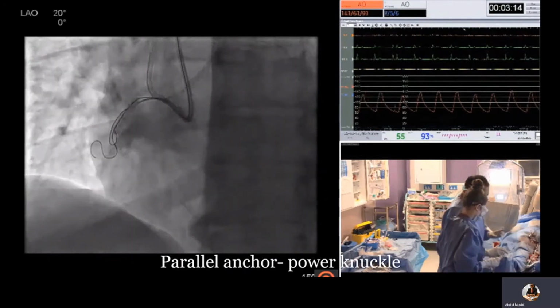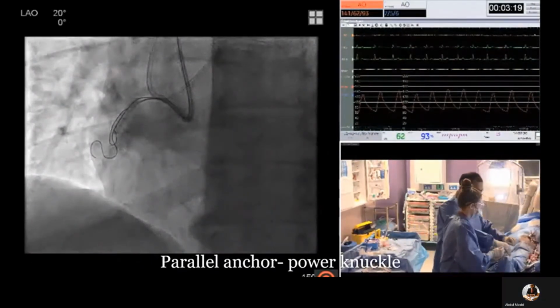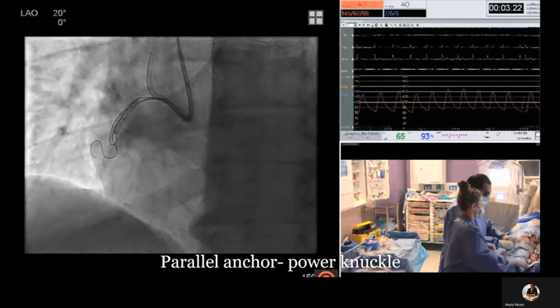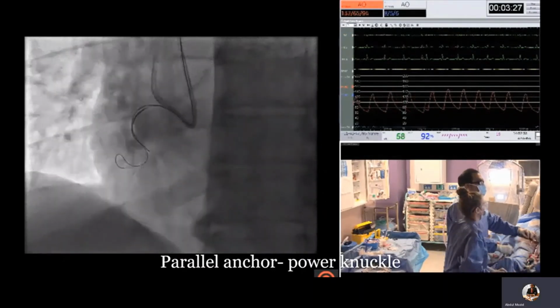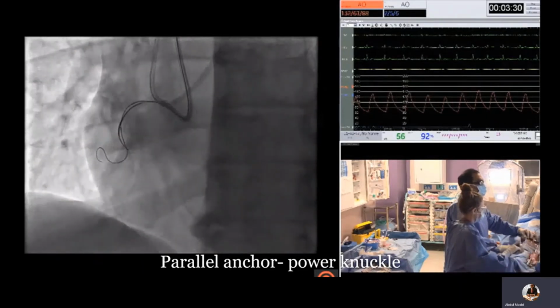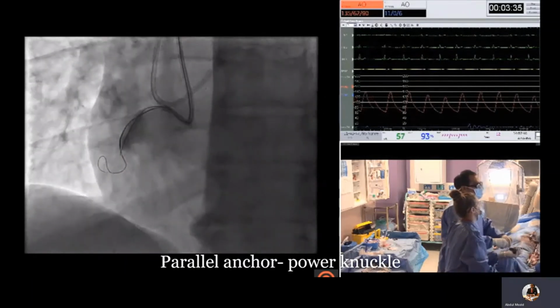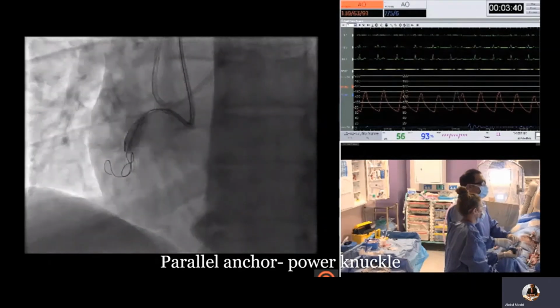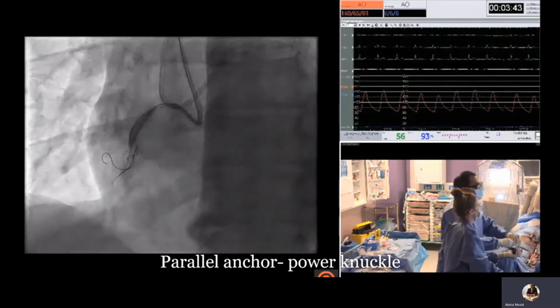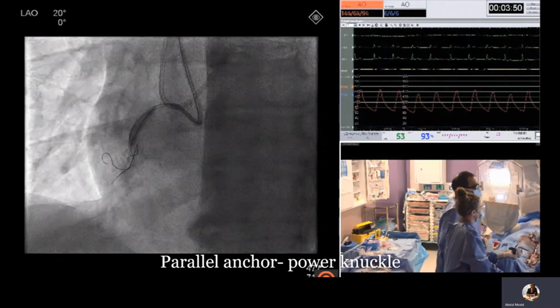So here's the Turnpike Spiral coming in. The balloon is deflated, and the Turnpike Spiral is delivered. The balloon is now inflated again, trapping the Turnpike Spiral and anchoring it to the vessel, and this is called a power knuckle. And then you can see, following this maneuver, it is fairly straightforward and easy to knuckle past the occlusion point with the Gladius.